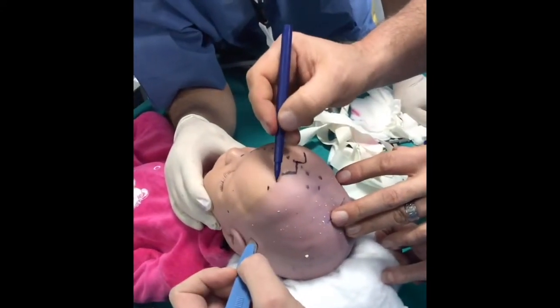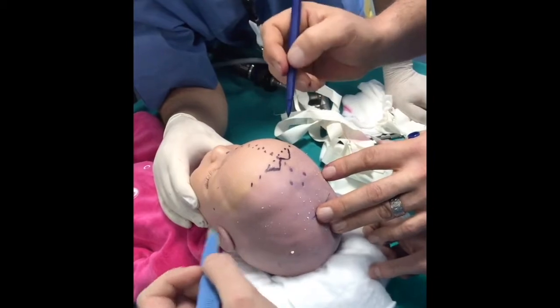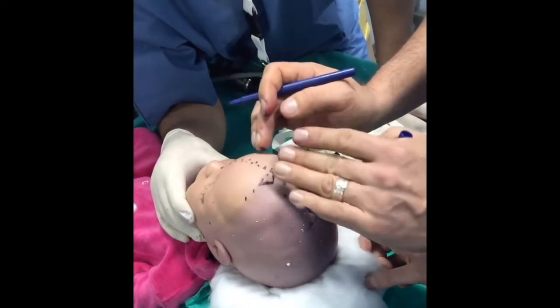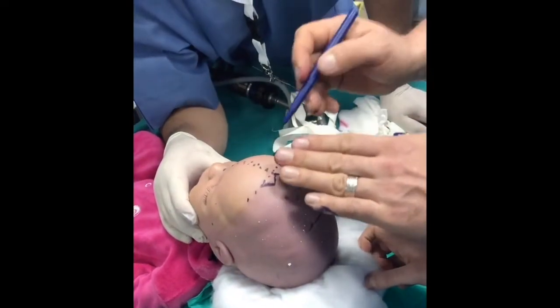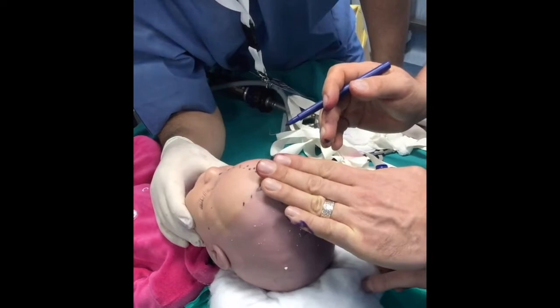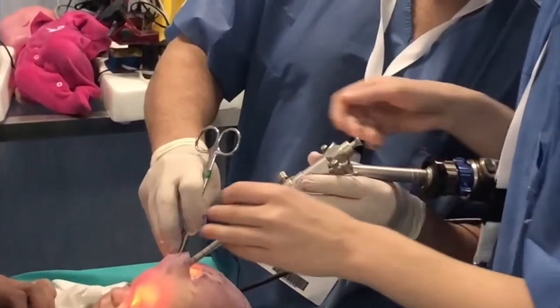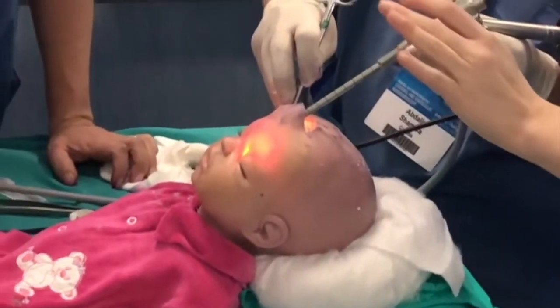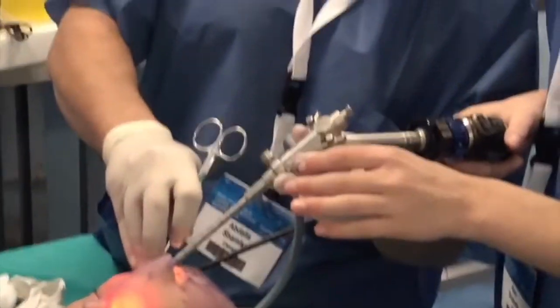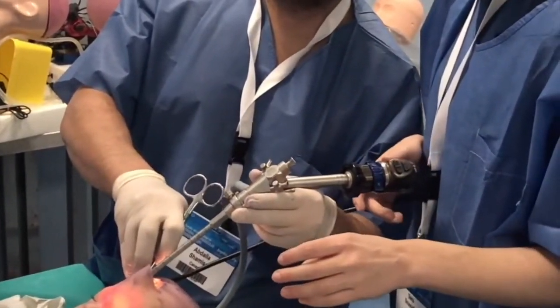The model presents a skin consistency quite similar to human skin, allowing trainees to experience the difficulties of the technique. Endoscopic technique. In the first step, skin is dissected from the bone. Then, the trainee can enter the endoscope to perform epidural dissection and bone removal.